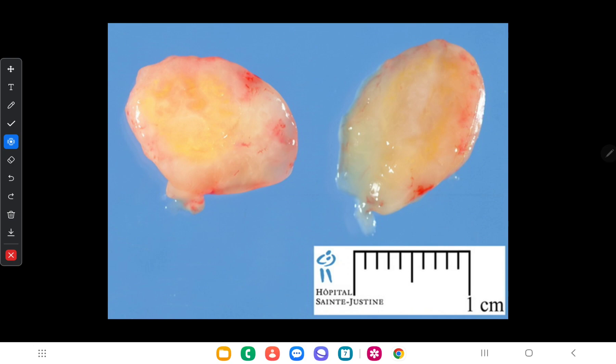In this video we will discuss microscopic and macroscopic specimens of tumors which originate from connective tissues. There are several types of connective tissues in our body, including peripheral nerves, adipose tissue, muscles, bones, and cartilages. First, we will have a look at tumors which originate from peripheral nerves.